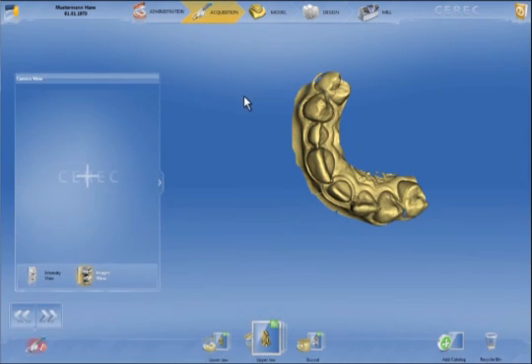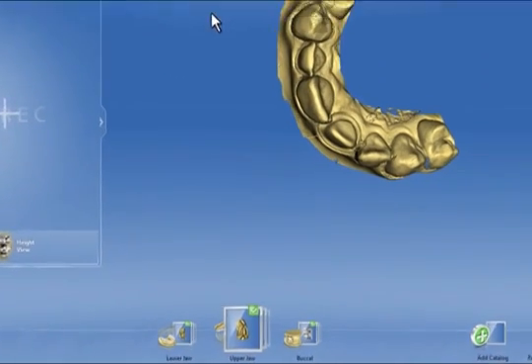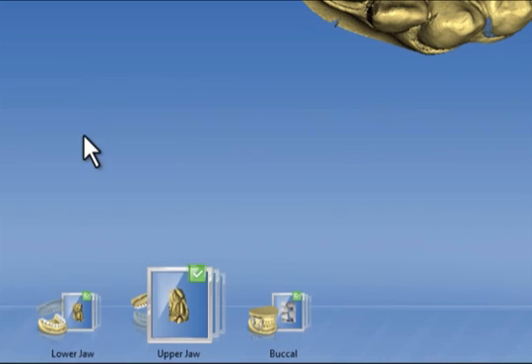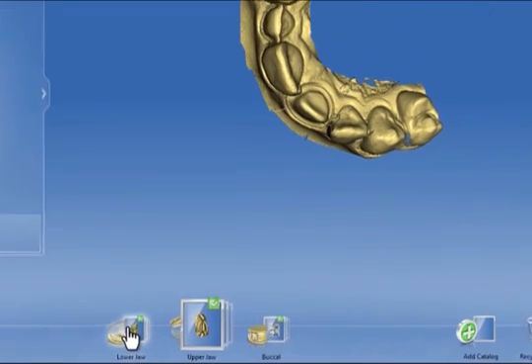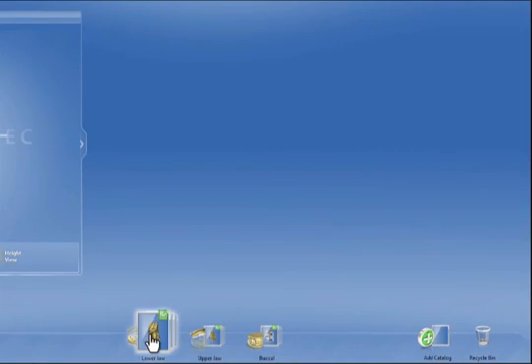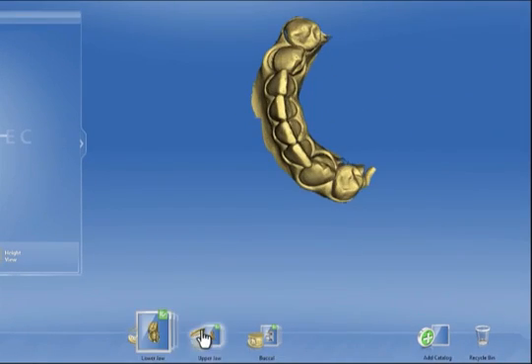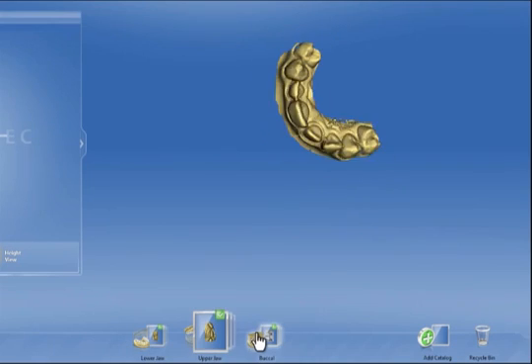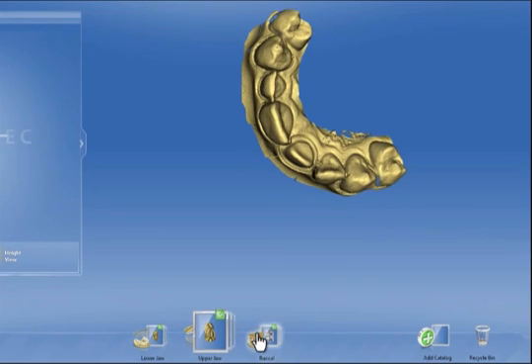Images are captured here with the intraoral camera. At the bottom of the screen are various imaging catalogs such as lower jaw, upper jaw, and buccal bite registration.